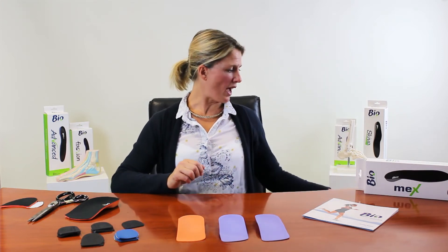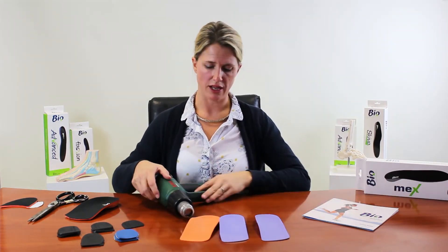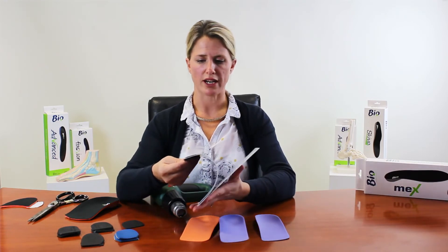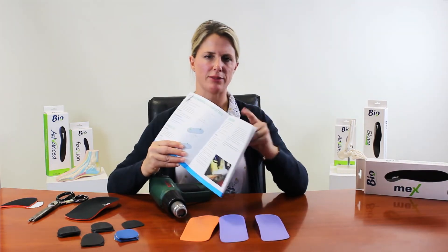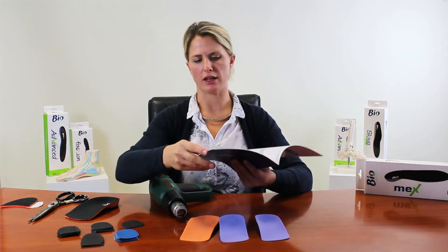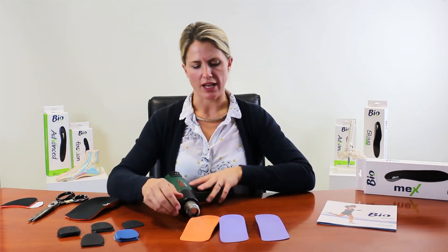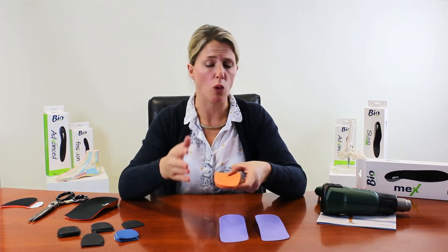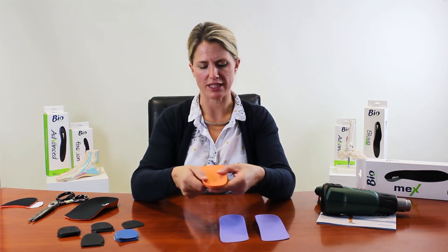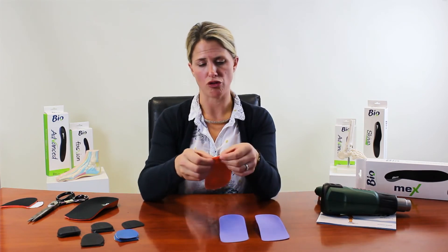If you have a heat gun in clinic, there are all sorts of things you can do. Make sure you follow the safety instructions — the training manual on page 21 gives full instructions on how far away to hold the gun, tying your hair back, and how long to heat for. With a heat gun you can increase or decrease the arch, heat mould around the heel cup for a wide foot to improve fit, and heat mould under the distal edge using a teaspoon to create your own met dome.